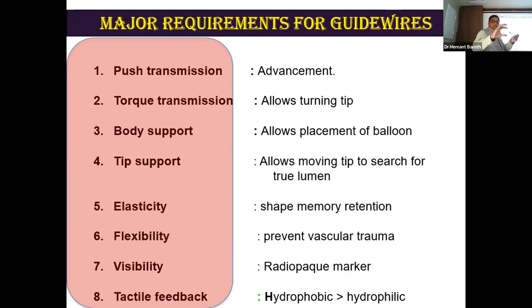Then the third thing is body support. The body support is the support that the wire gives when you push a device, whether you push a balloon or a device. So for bulky devices, you require more support.